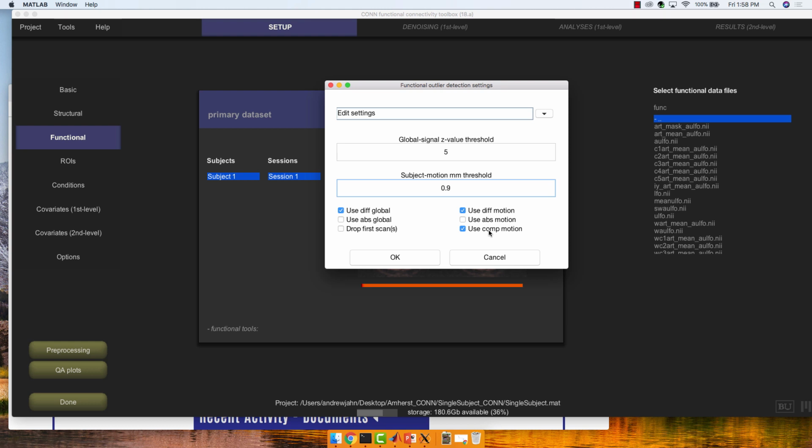It also depends to some extent on the voxel size you're acquiring. If I had 3 by 3 by 3 voxels, you're probably less likely to run into major problems with moving, where one voxel is being measured from one tissue type to another, if the voxels are relatively large than if they're pretty small. But 0.9 for most cases, I would say, is fine.